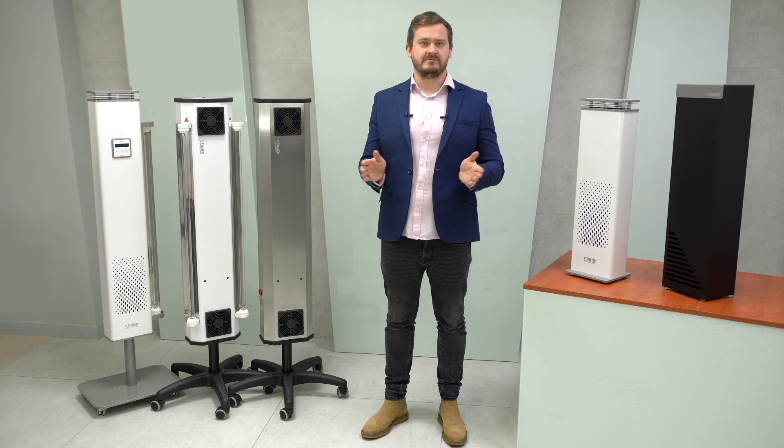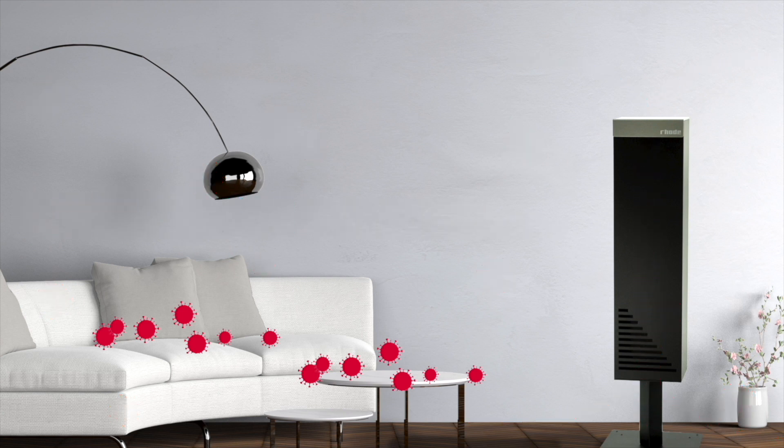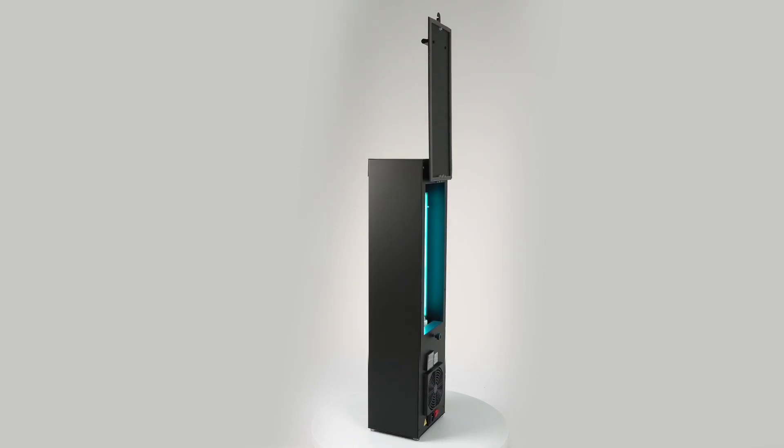We will start our presentation with the box model. Its modern design with the style of a cube, with elements made of aluminum covered with metallic varnish, makes the device fit perfectly in any room. The box is available in a single function version intended for air sterilization, as well as a version with an open panel which allows direct irradiation. Unlike other structures, the panel is not removable, but hinged.